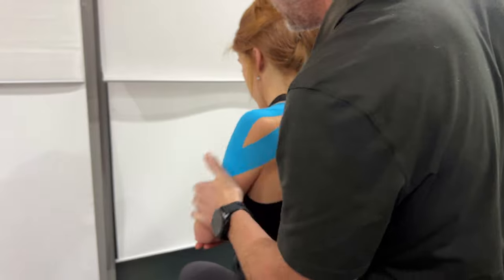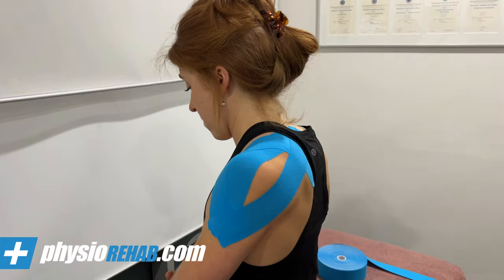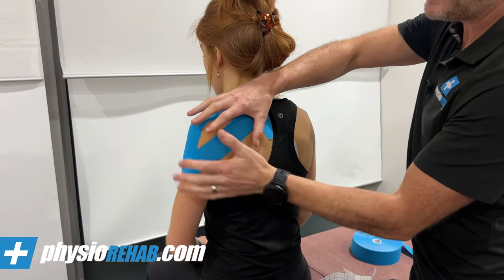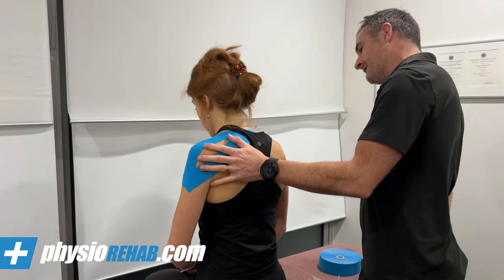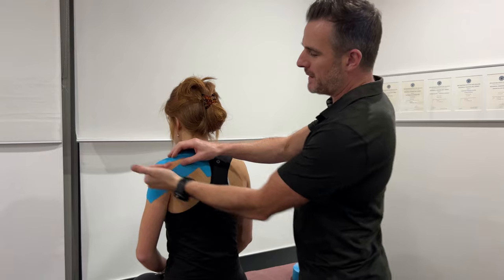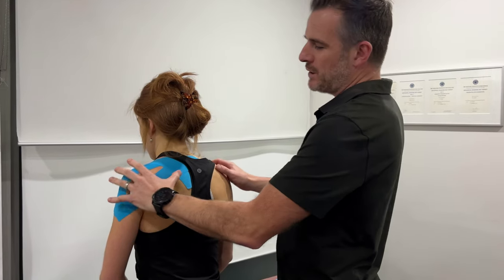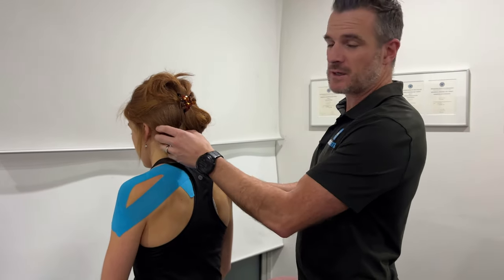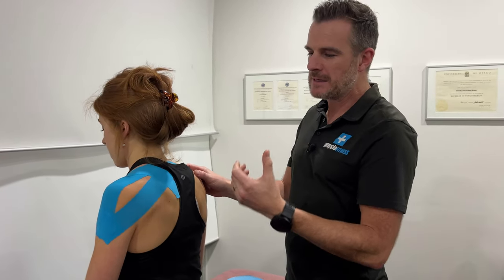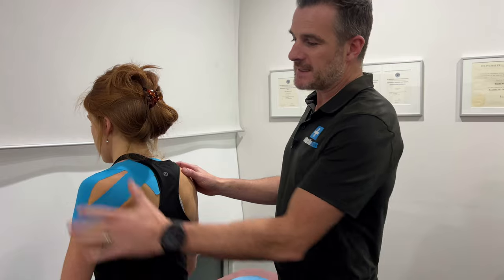What you've got now is three bits of tape pulling up into that position. When she lets go, the tension of the tape is holding the humerus up a little bit and also holding the scapula up a little bit. They feel really supported with that. It's super helpful for people with impingement, bursitis, a rotator cuff tear, or even those with a dropped shoulder from a neck issue that's giving them aching. It just takes the weight out of that shoulder, helps them recover faster, and gets the exercises done. We find it super helpful — so that's how I do it.